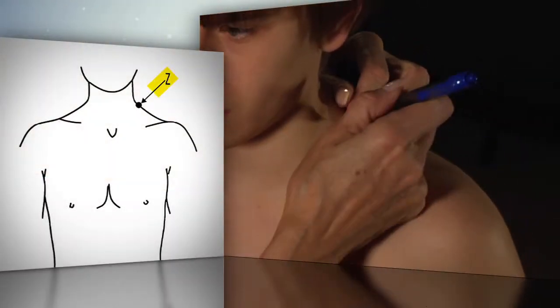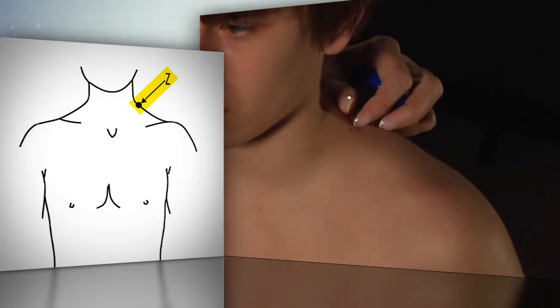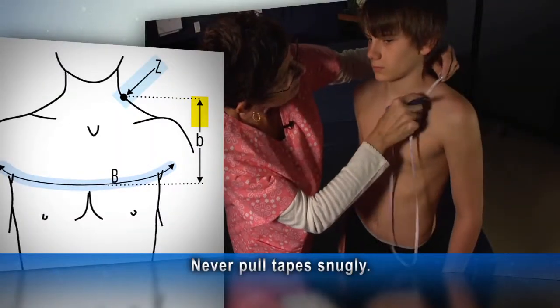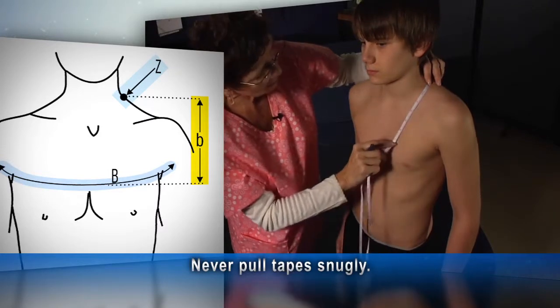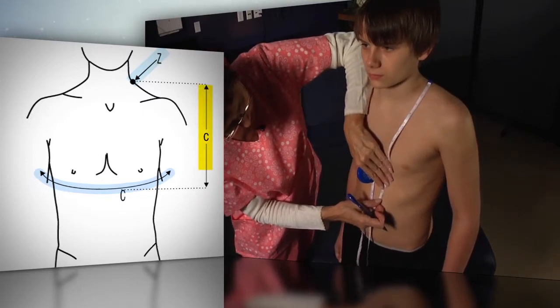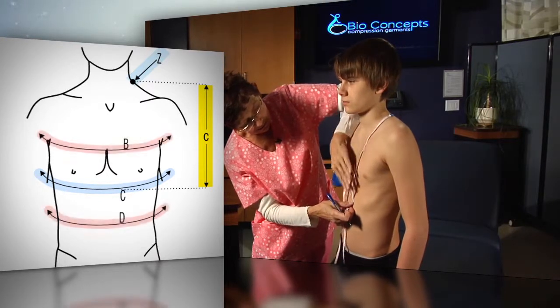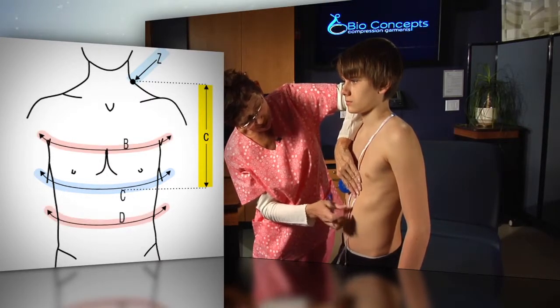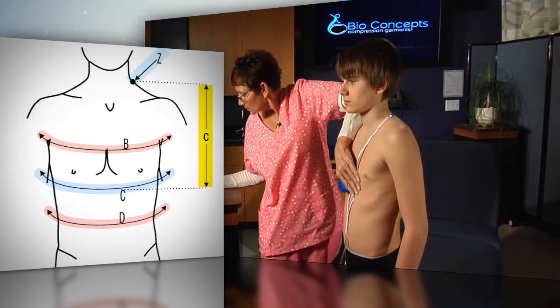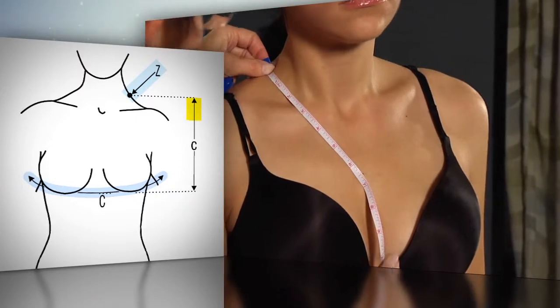For surface measurements, start by locating point Z, which is located at the base of the neck at the top of the bulge of the trapezius. The little b measurement is the distance from point Z to the capital B circumference. The little c measurement is the distance from point Z to the capital C circumference, which for an adult male or child of either gender is halfway between the capital B and capital D circumference measurements.